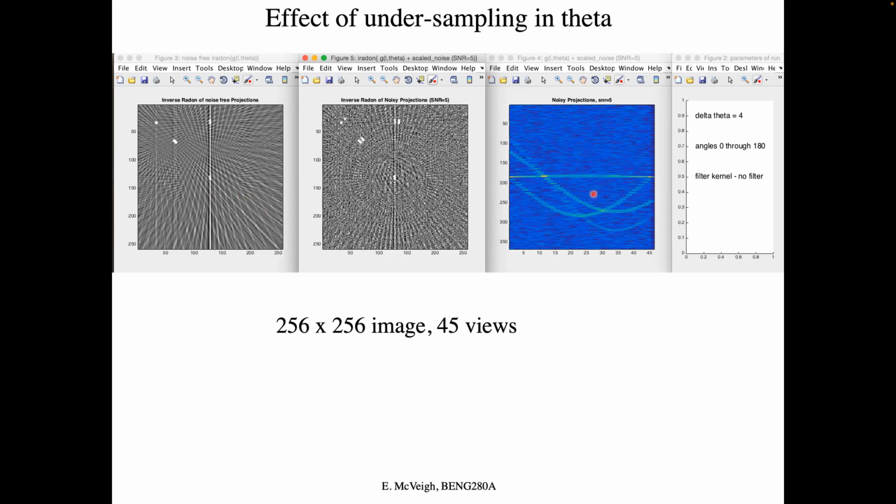And then when you add noise to your data, this turns into this. So you still see there's structural artifact in the whole picture. That is evident even though you've got this noise on top of it. And in fact, the noise will give us a hint as to when the number of projections is sufficient, because when we see that the noise gets better in its behavior, we can assume it's sufficient.